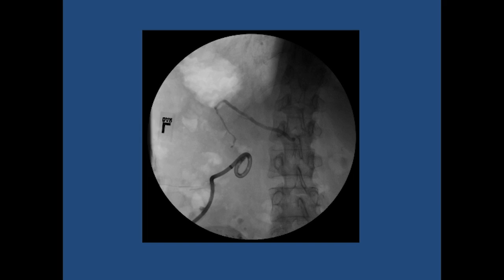the communicating structure. So imagine a drainage catheter within a biloma, and the biloma has resolved. The drain is injected with contrast, and there's communication with the biliary tree and subsequently propagation of contrast into the bowel. The normal downstream flow of what we expect bile, and in this case contrast, to go.